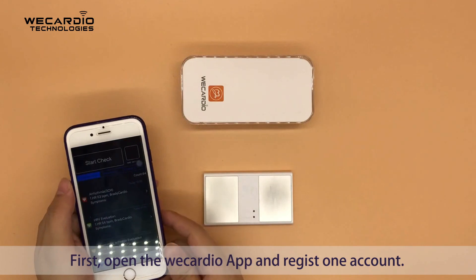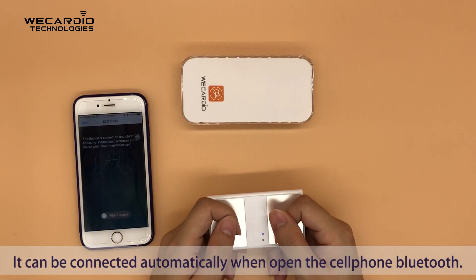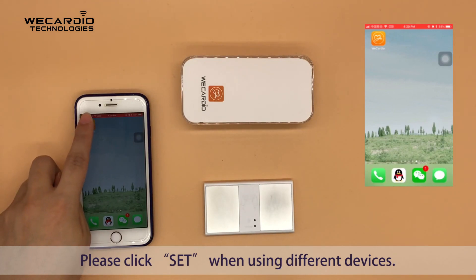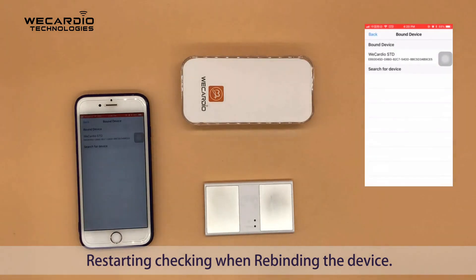First, open the WiCardio app, then register an account. It can connect automatically when you open the phone's Bluetooth. Please click 'Set' when using different devices. Restart checking when rebinding the device.